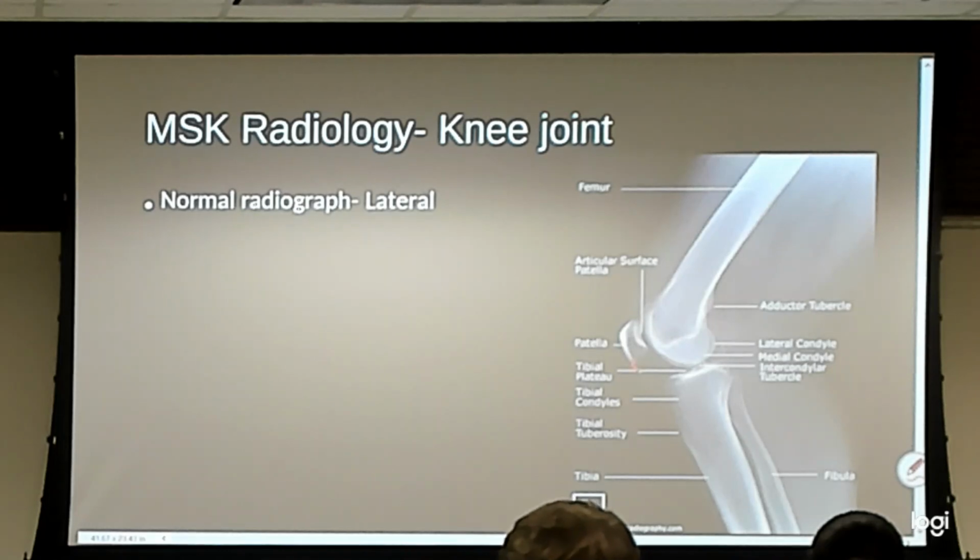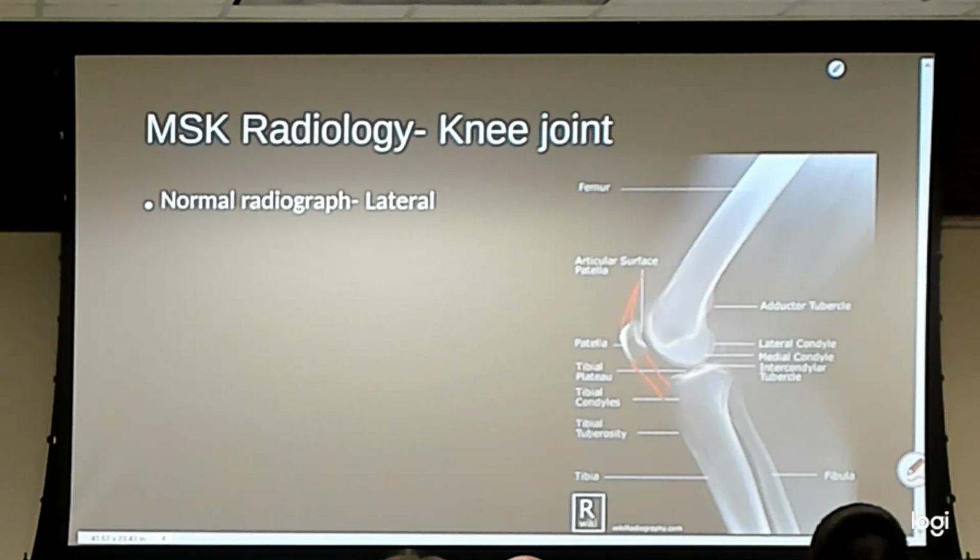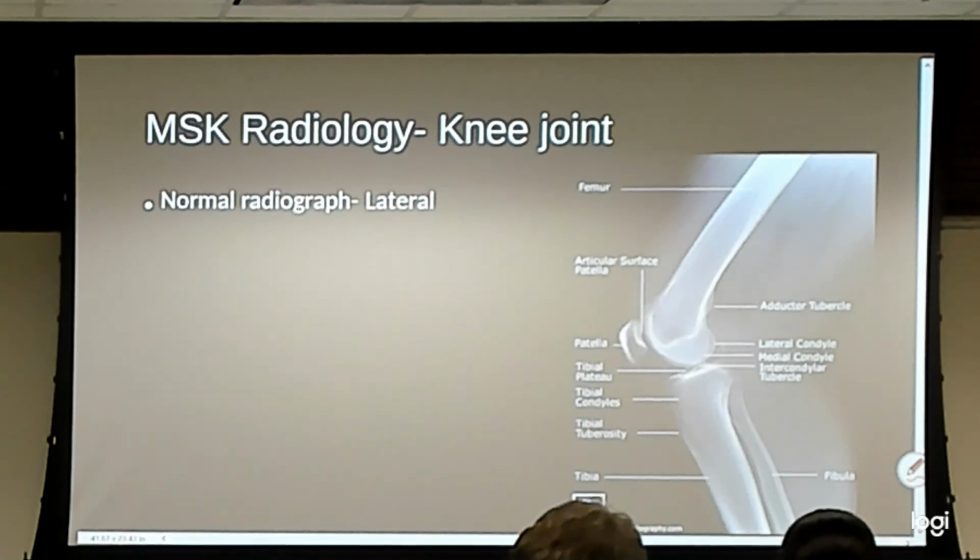So we're looking for the dark lines. You see them a little bit more there. I think yours has a, yep, so look for the dark, not the light. The light is fat and other joint fluid, so you're going for the dark, not for the light. And then quadriceps tendon is at the top, superficial. On yours you have white deep to that. Quadriceps tendon is the superficial dark part. Patellar tendon, quadriceps tendon. Anybody need me to go back?